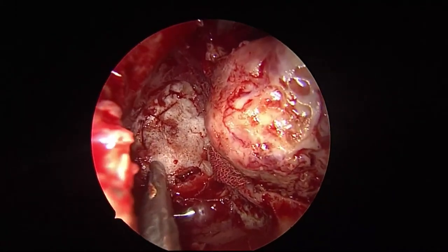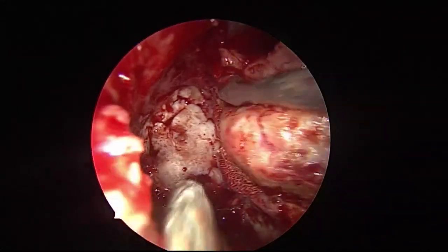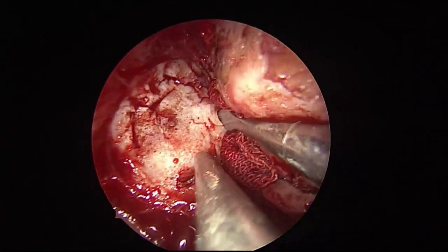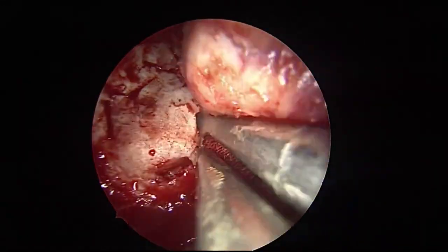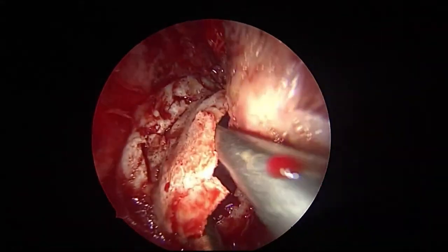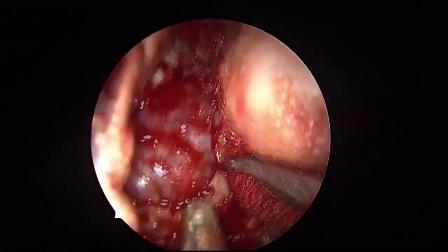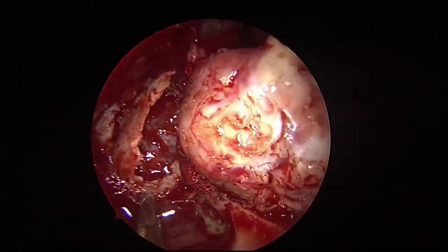See, I could have drilled it as well. Yes, sir. Since the bone is thinned out, why didn't you use the drill, sir? I can crack it easily. See this? Posterior wall removed. It is much faster, much easier. Why use the drill unnecessarily?